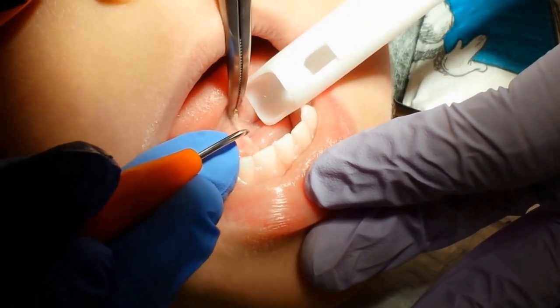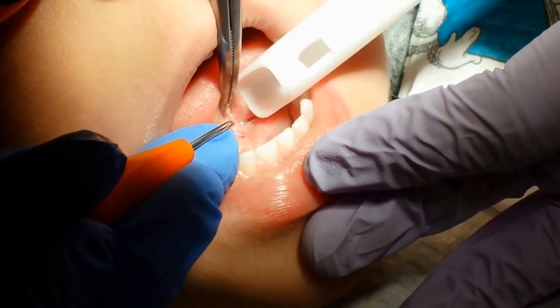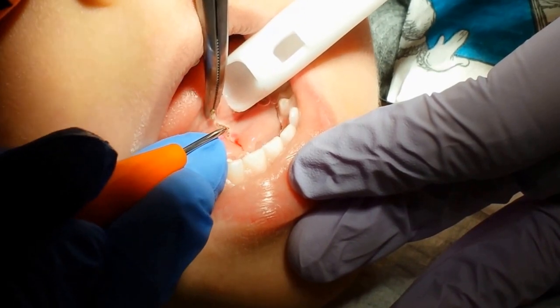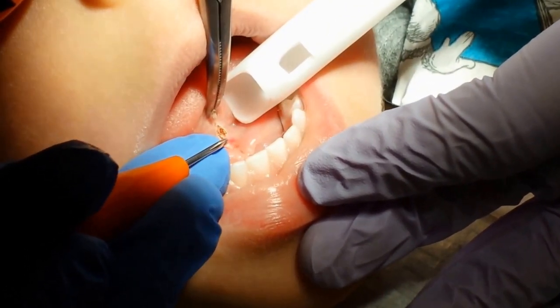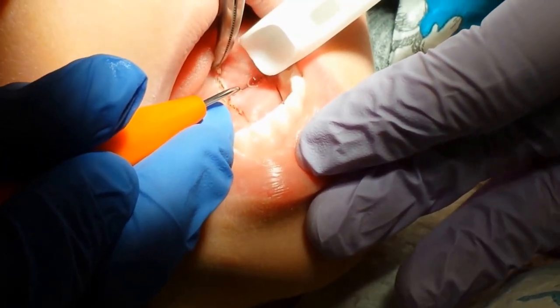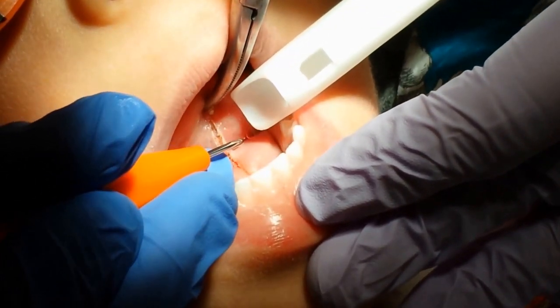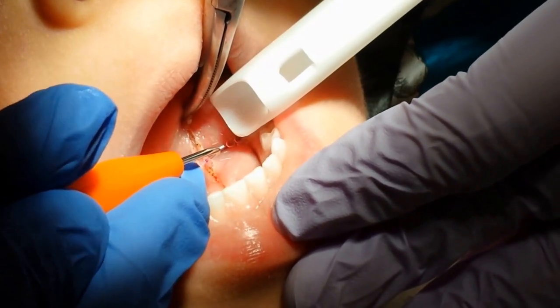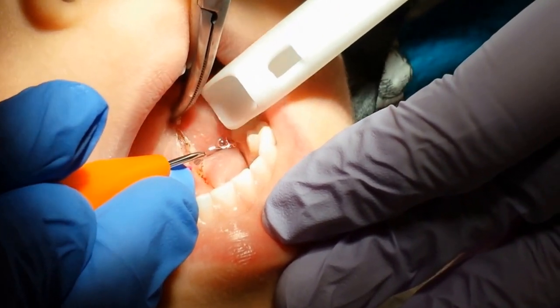Let's spray it again. Now this will allow his tongue to be more mobile as well.